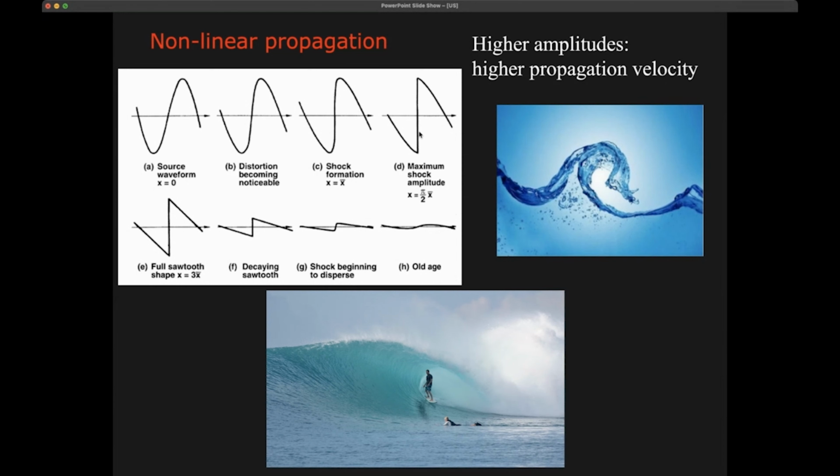While with the nonlinear propagation, we start generating higher and some lower frequencies. So this really is nonlinear. And mostly we generate double frequencies and then keep on generating what we call harmonic frequencies.